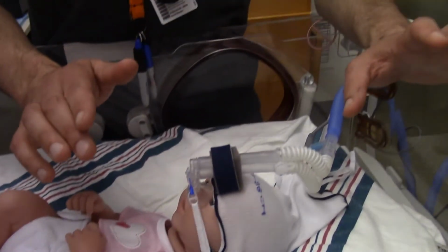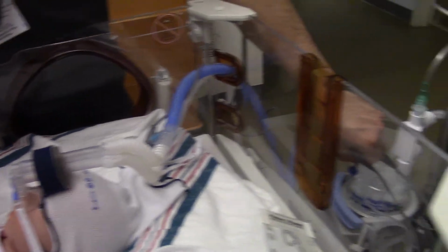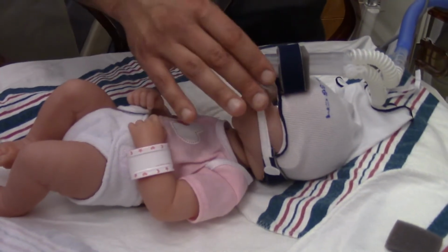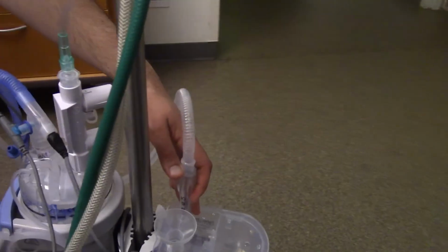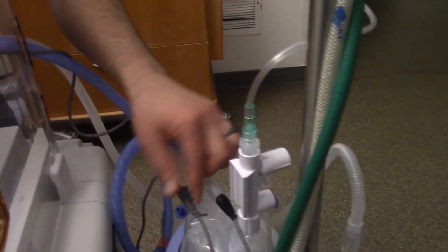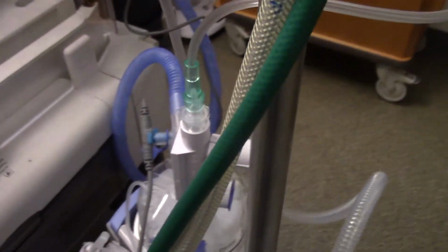Some last key things to do as far as that troubleshooting: if your bubble is very weak, number 1, listen to the patient, see if there's something wrong with the interface, and then work your way back. Is my flow on correct? Do I have the correct CPAP? One of the biggest ones, as we've all seen, it doesn't take much, and I'll show you now.